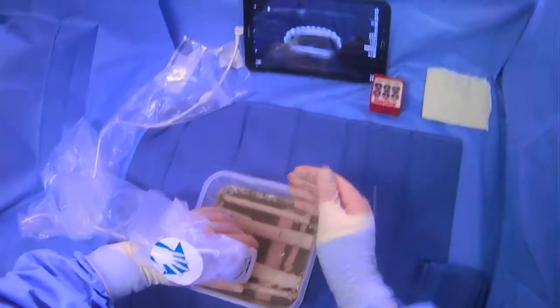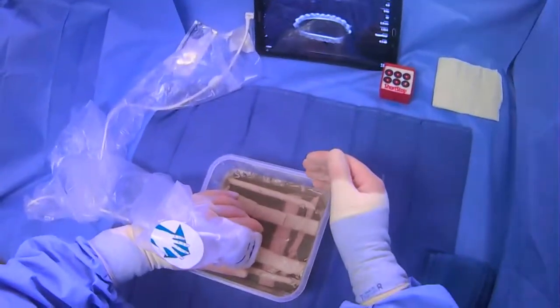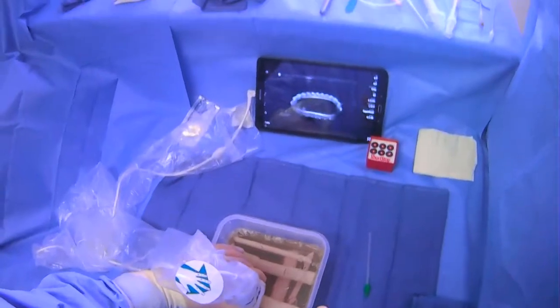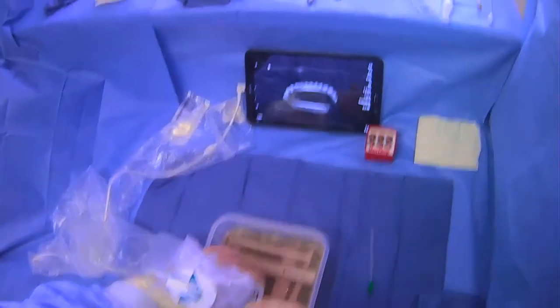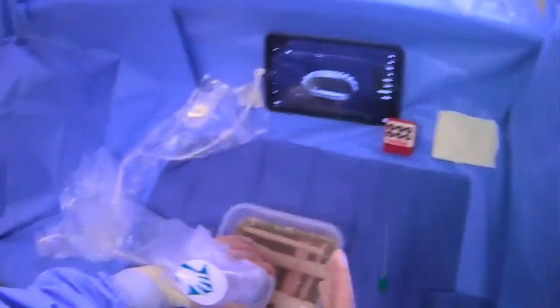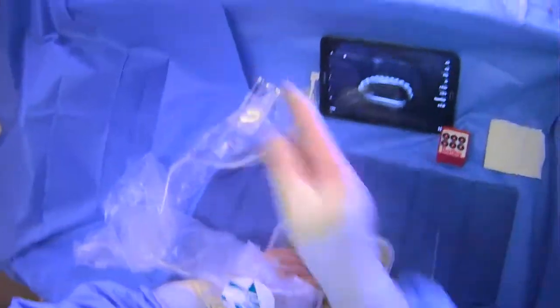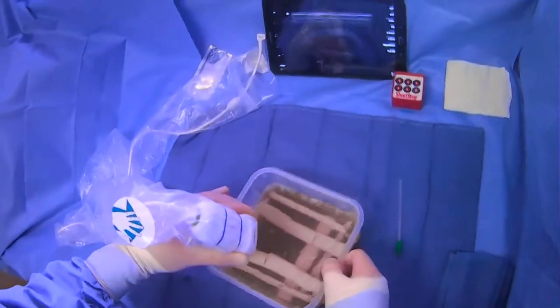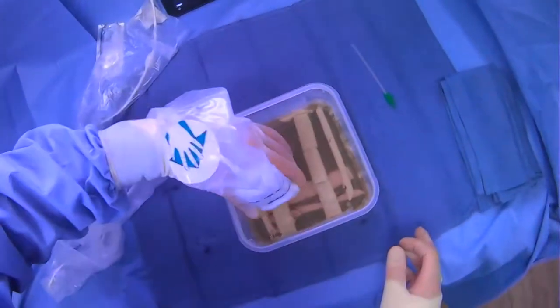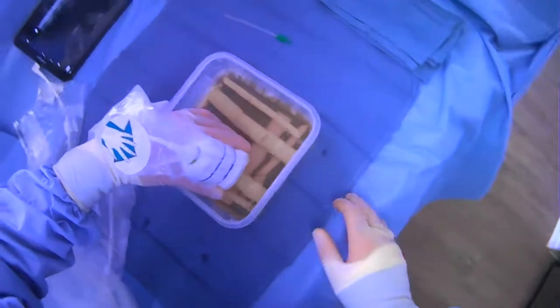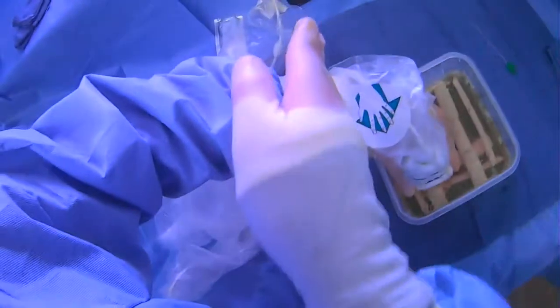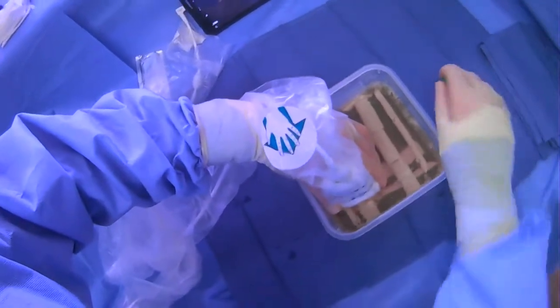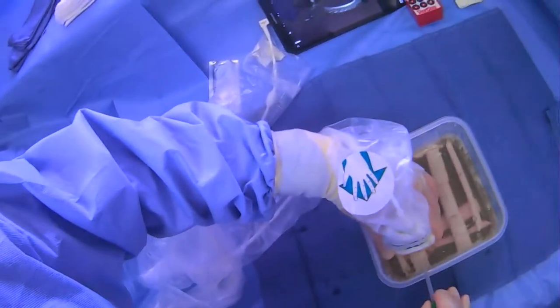I am not going to be standing at the head of the patient now. I'm going to be standing on the other side. And I need to make sure that there's room for my ultrasound screen right across from me before I attempt to do this. Otherwise, I may have to crane my neck if the screen is over there. So for example, with our original orientation, if I was to stand over here, then I would have to look over to the side as I try to gain access. And it's not really as natural of an angle.